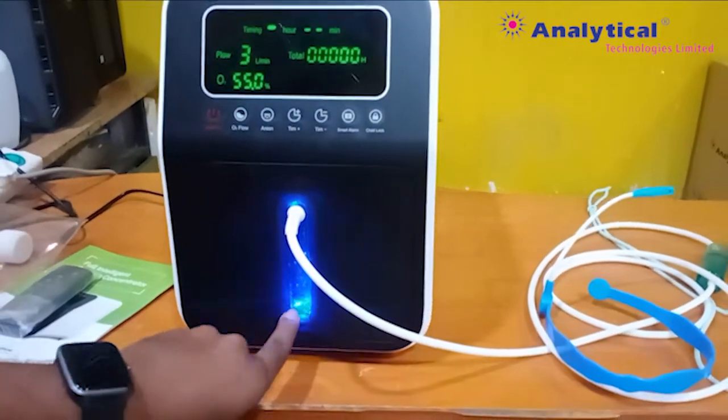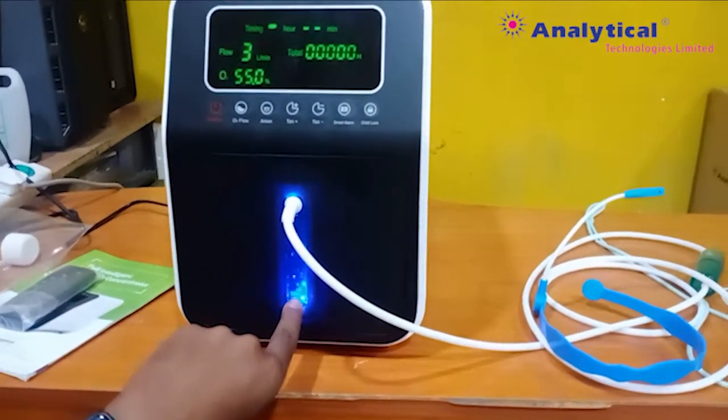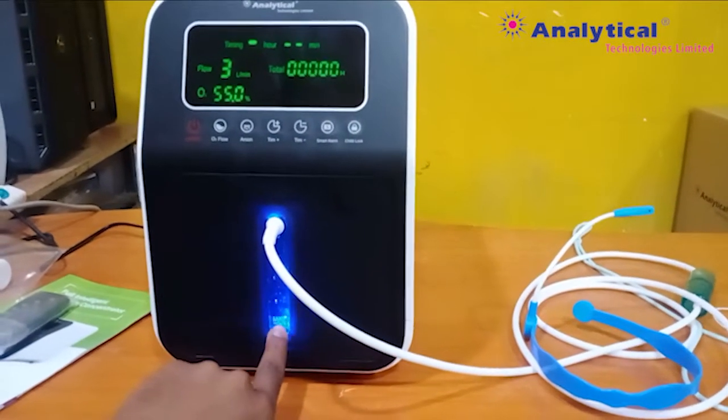First of all, you need to maintain the maximum level of the water. You can see the mark on the glass.